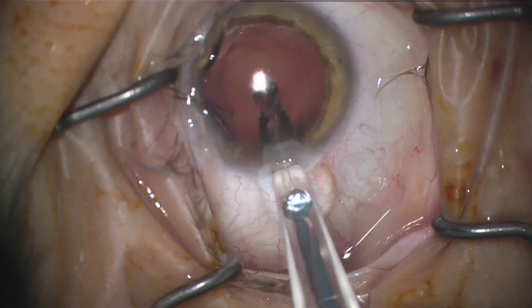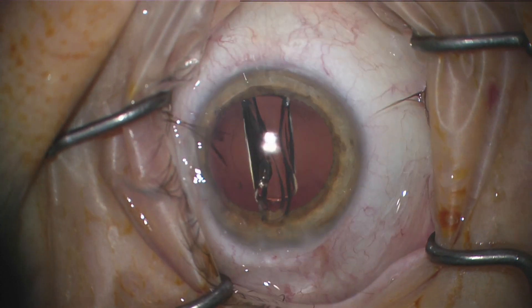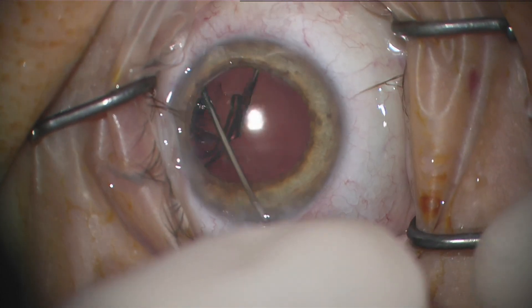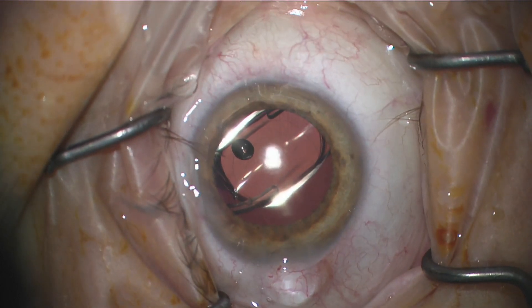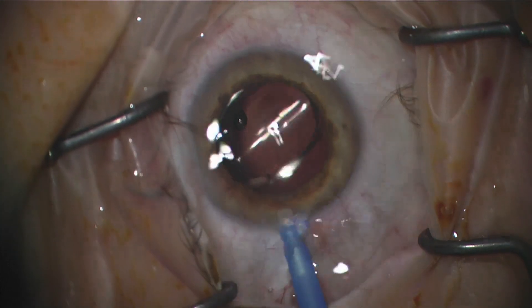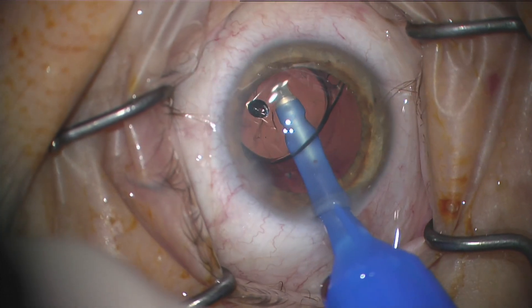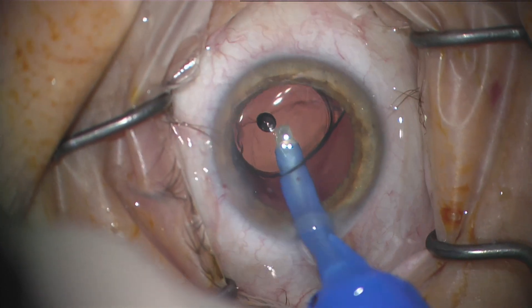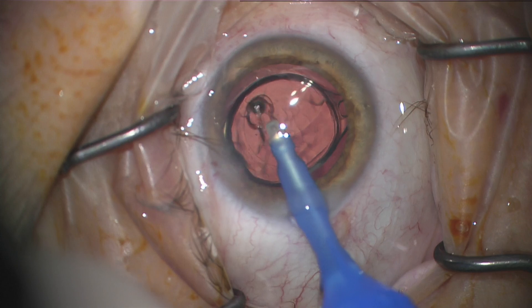Because it's a bigger wound I can inject the lens in nicely myself — no big deal. It works, as you can see everything's gone. It took a little bit longer on the phaco part than I'm normally used to, but that's probably because I'm conservative and not pushing the throttle all the way. The rep was telling me you really have to push the throttle — I was pushing at maybe 75 percent, but you have to get down to 90 to 100 percent to really get the full cut.